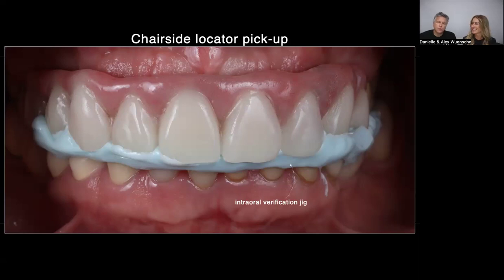And these are the little things, right? What I always see when I am chairside with my clients, or we are supporting a new client who has questions on how to do certain protocols. These are the little things that really help a lot. I always say if you work more in advance on the case and prepare every single step, like that little tray Veronica showed, the pink tray, put everything nicely in, you have full control, perfectly organized.